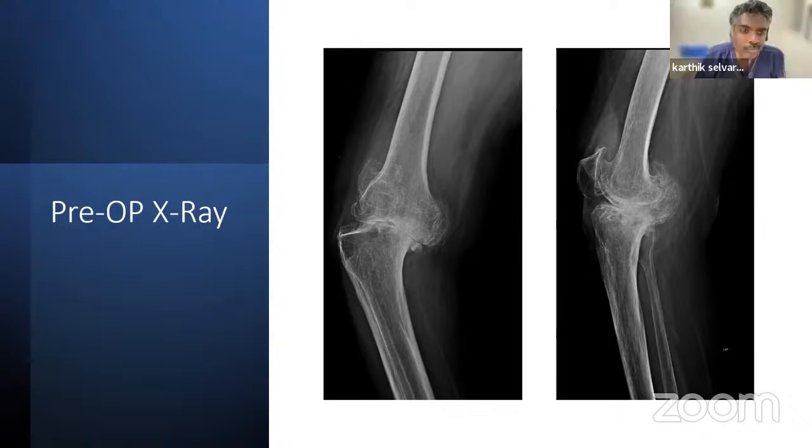So I think reduction osteotomy. What osteotomy do you mean? Reduction osteotomy you mean, or epicondylar slide? Epicondylar slide is only in rare cases. Generally do not do epicondylar slide because it is easily said. But the moment you slide, the fragment comes down. You have to lateralize the component. It may hinder the insert.